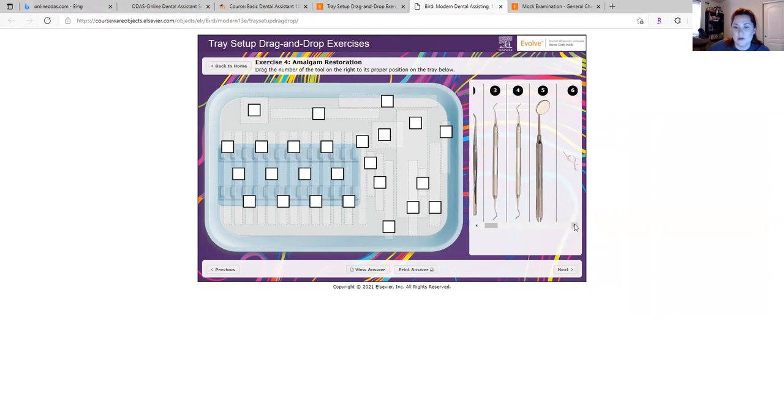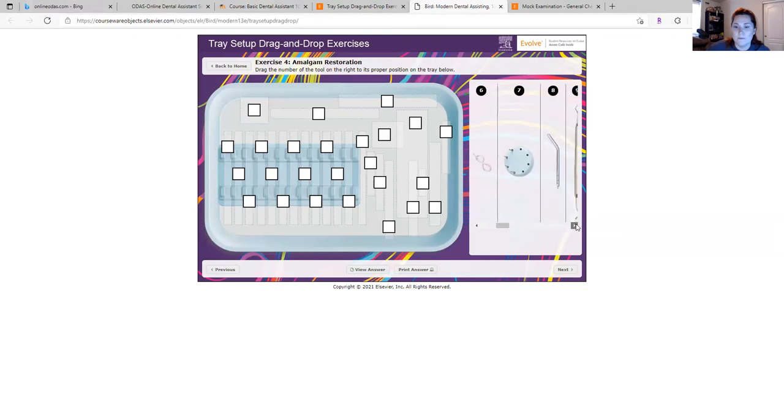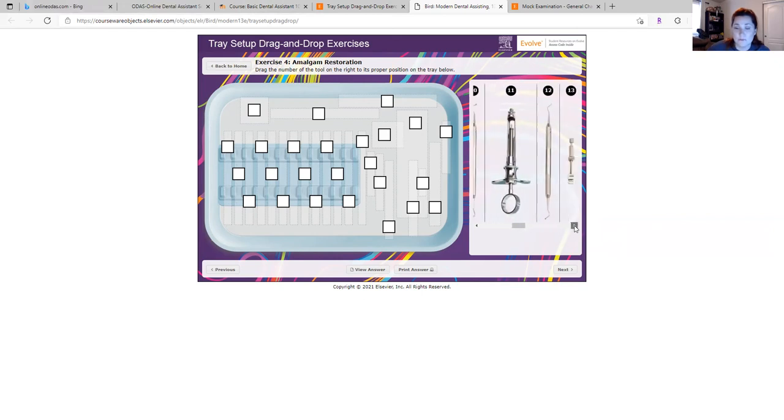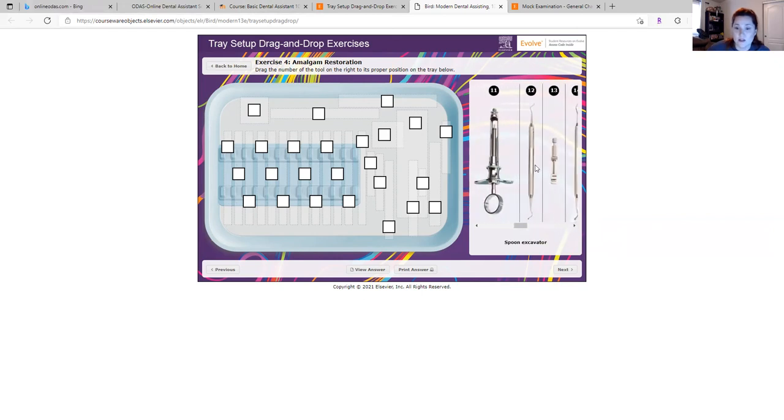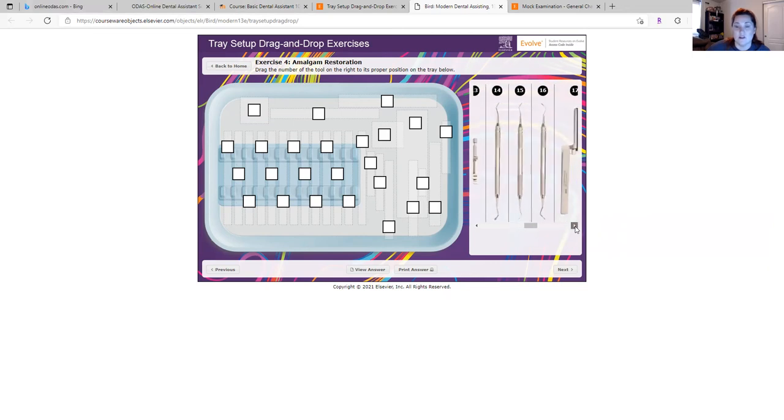So you can learn the name of the instruments, what it's used for: air, water, small condenser, acorn burnisher, syringe. These are all, it's just great to learn these instruments.